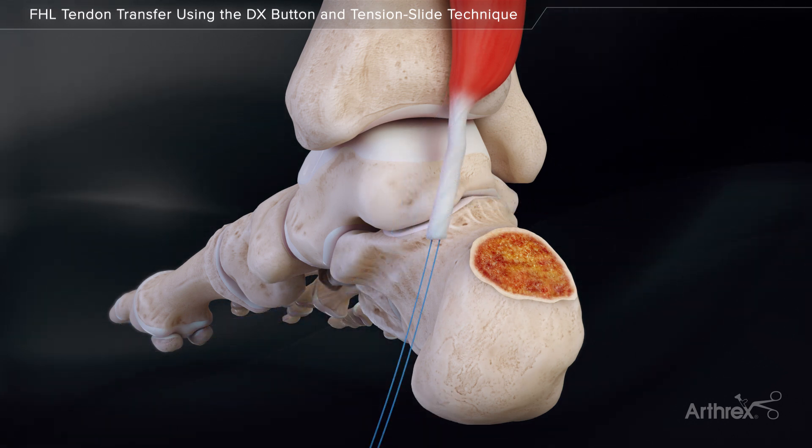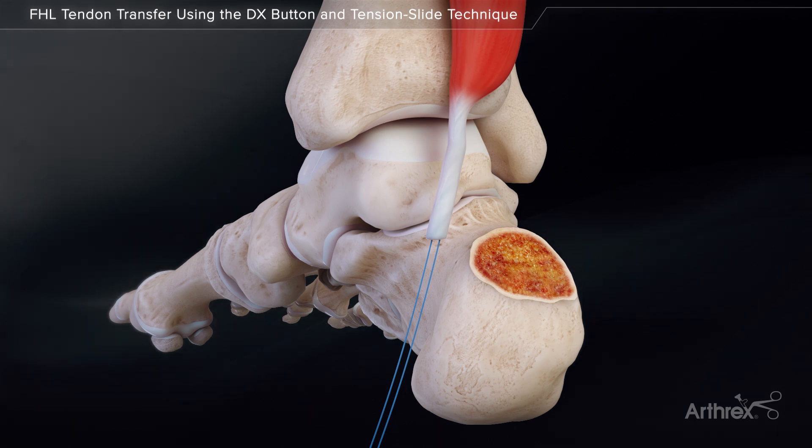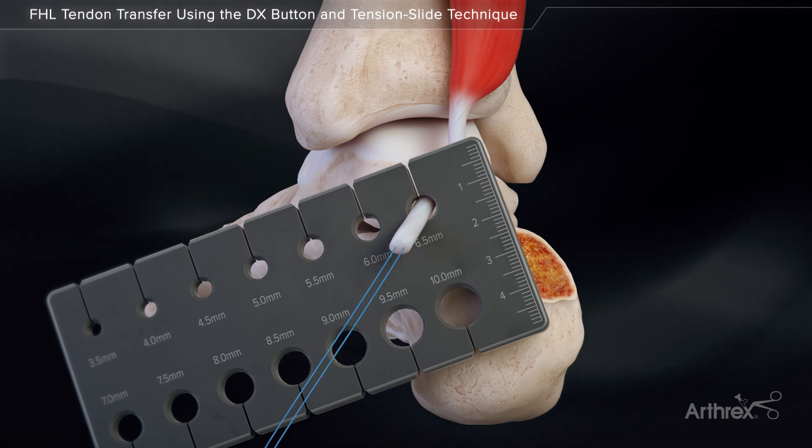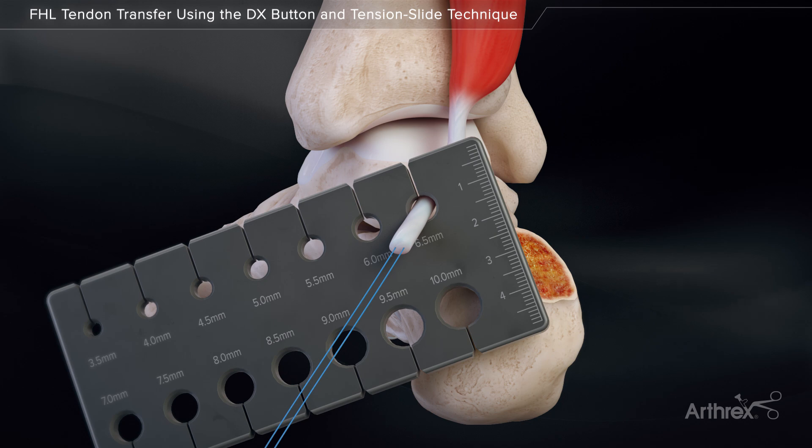Place a traction stitch through the tendon using a No. 2 fiber loop suture. Size the tendon through the tenodesis graft sizer. Based on the tendon diameter, open either the 6.25 mm or 7 mm FHL implant system.